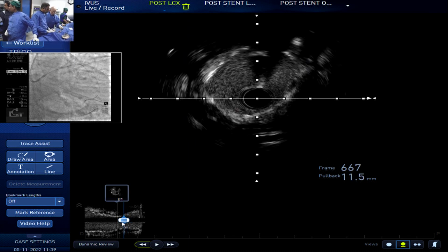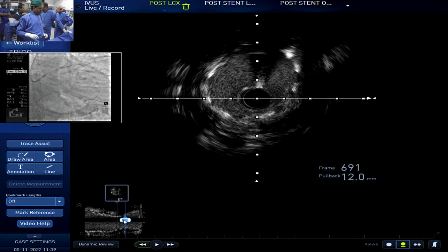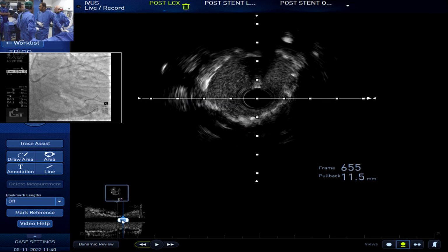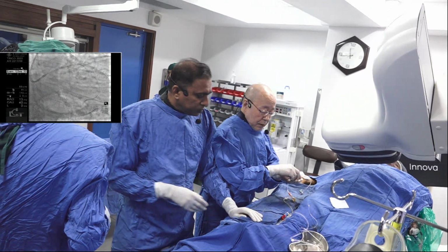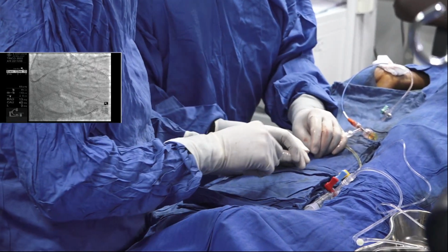So this is the last one? Yes. Just check the angiogram, that hematoma, make sure it hasn't changed. We think this is the last. Dr. Saito, any explanation for this kissing balloon step when you feel the ostium of the LCx is okay on angiography? Is this one 3.0?